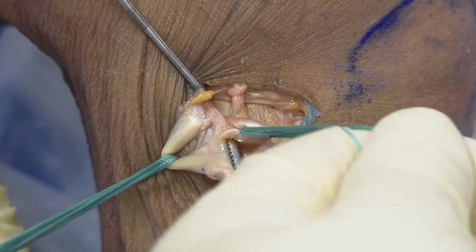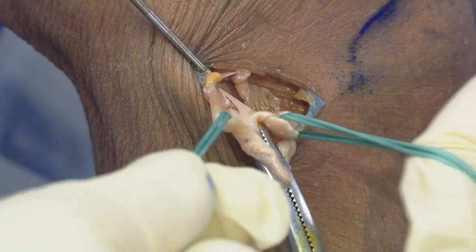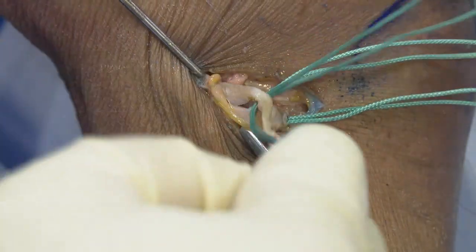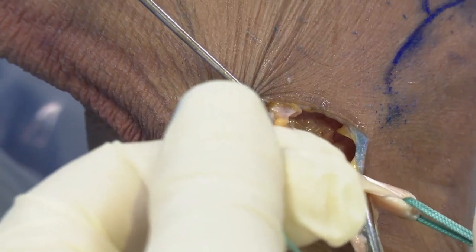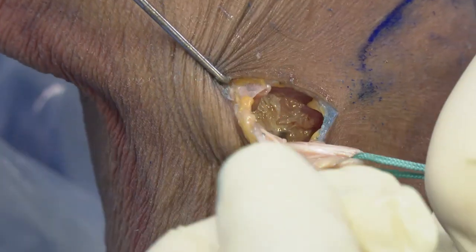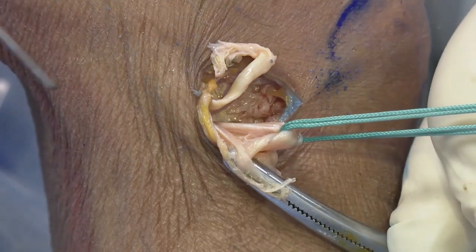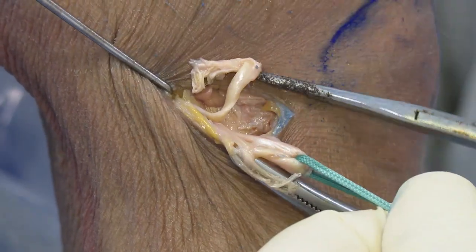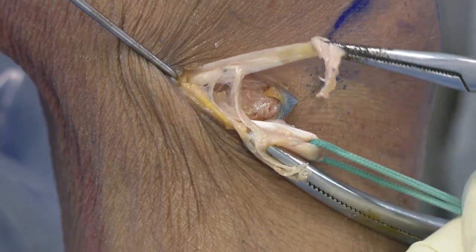So, here, like this, you have two tendons. One is gracilis, one is semitendinosus. Okay? In the left hand is the gracilis, in the right hand is the semitendinosus. Okay, and this technique you can slowly pull like this. Yeah, pull this because the distal insertion is already cut. Pull like that, okay? And then you harvest here. After you pull, it will break off naturally.